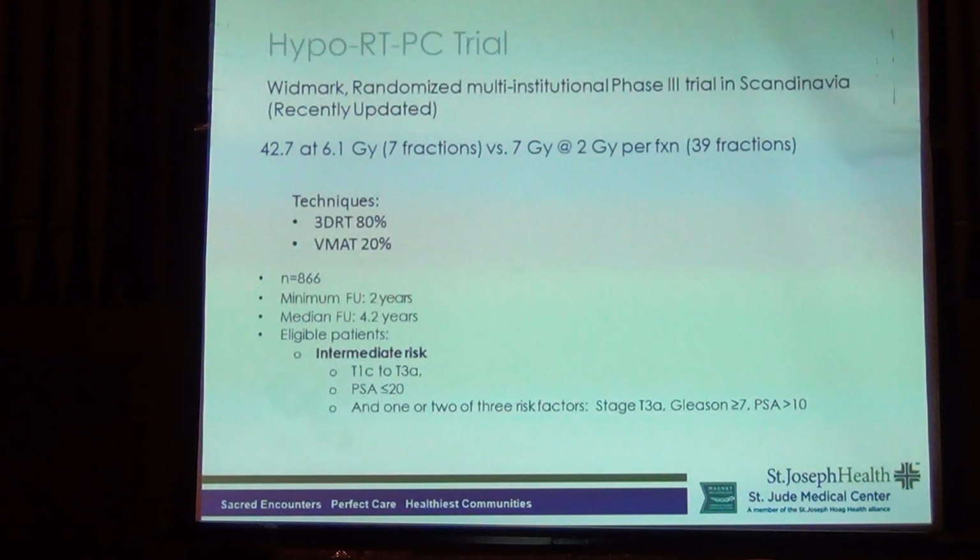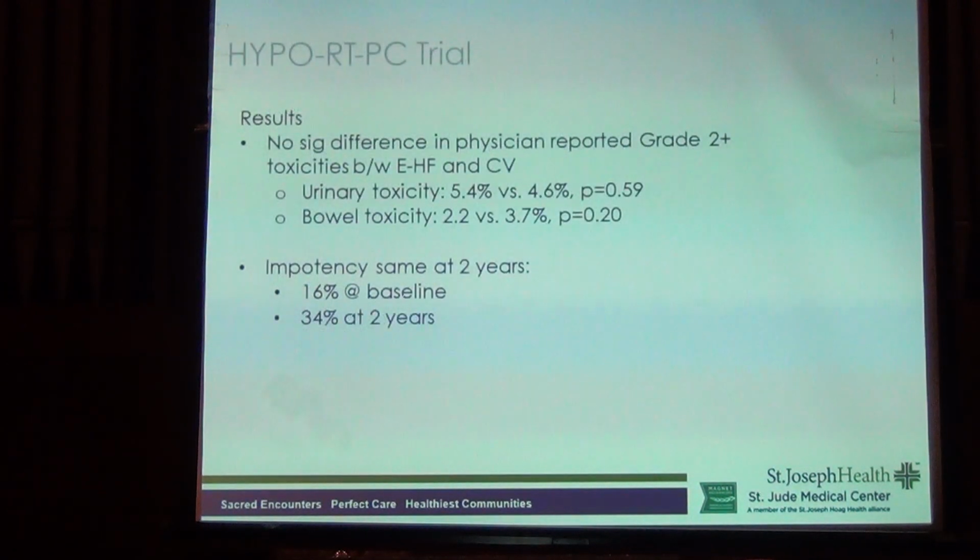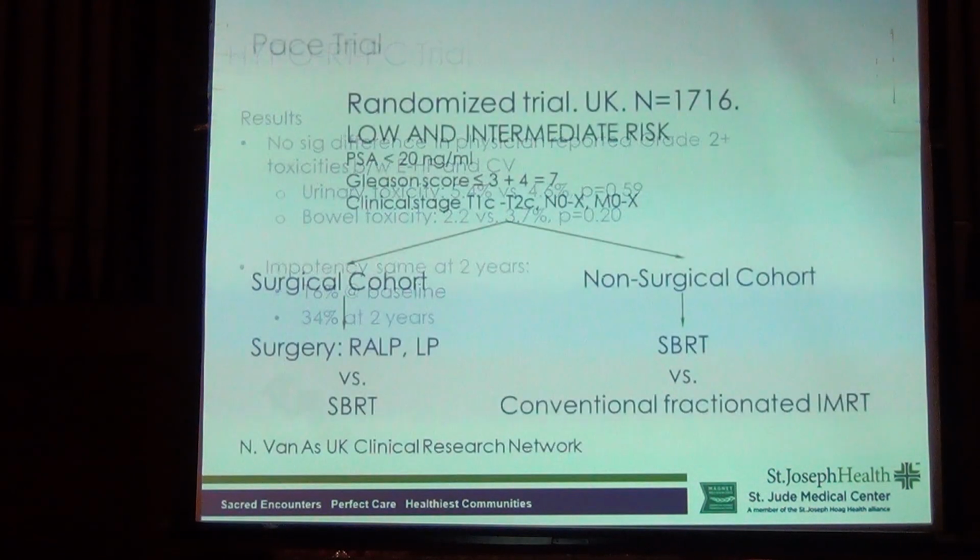So some of the newer data we'll fly through. Basically, we're getting to modern data showing that this works. And it's also showing us our toxicity scores, side effects, are now down to 2 to 5%. And that's really low. I mean, we're treating with a curative approach in 1 week without the side effects of surgery, and we're really doing quite well with that.